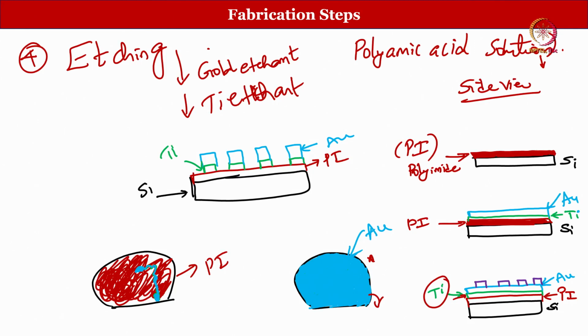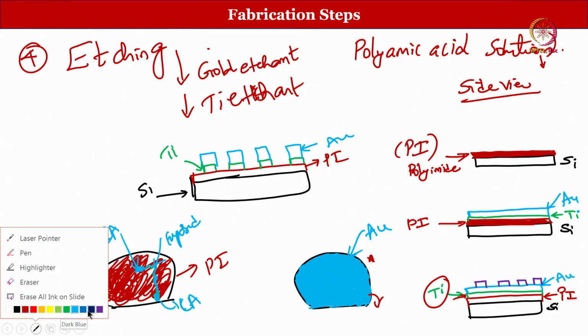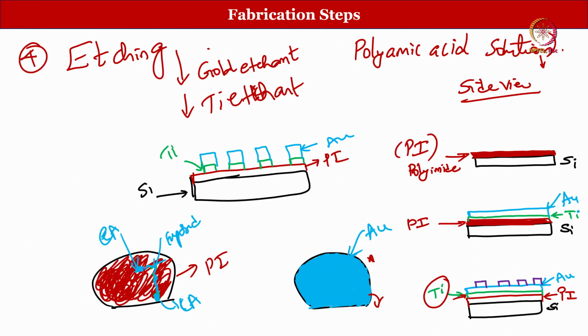Now, this entire thing is exposed, you see, but what you need to expose is only this electrode area and the contact area, only those things, okay. EA stands for electrode area, CA stands for contact area, only those two things will be exposed, the remaining things should be covered, passivated or electrically isolated. So, I use this color from here, this entire stretch of the interconnect has to be isolated, only the electrode.